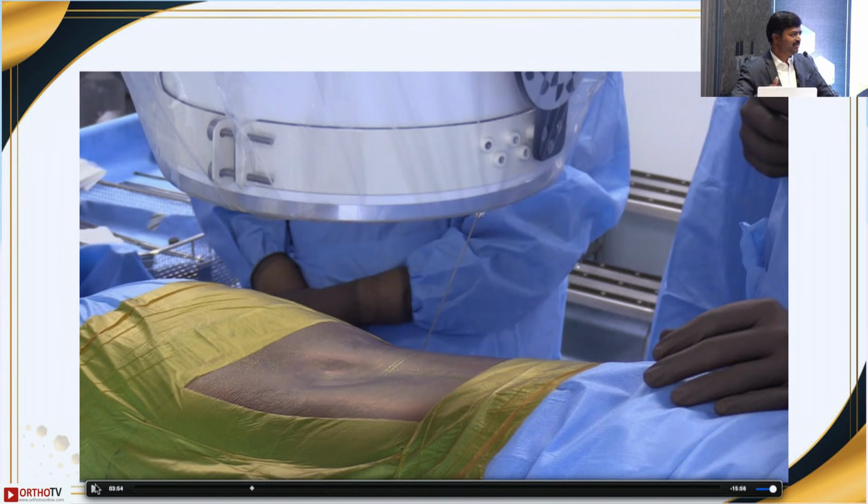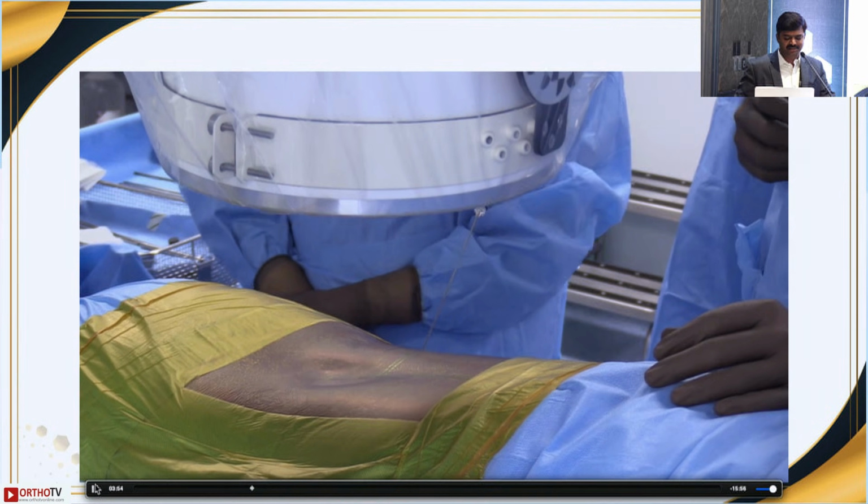So most of the time L2-3 and below, that is L3-4 and L4-5, it will be somewhere between 12 to 14 centimeters. As you go up, it will be around 10 to 11 centimeters. L1, L2 around 10 centimeters. In our Indian population, most of the time it matches, and when you calculate on the MRI with a bigger FOV, it matches. So we're writing on that. We'll come up with the exact number, but most of the time it is correct. That's what we found in our observation.